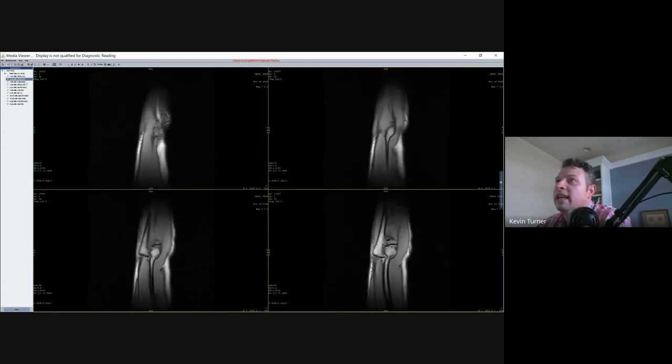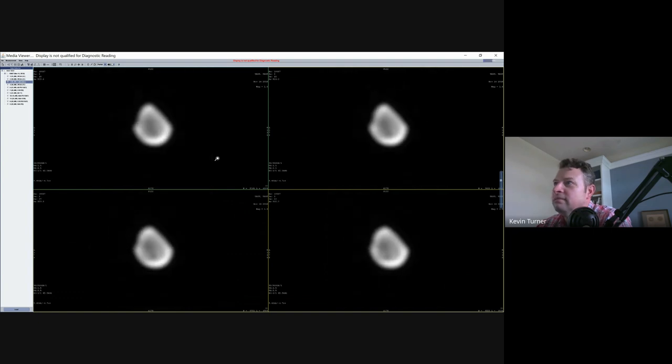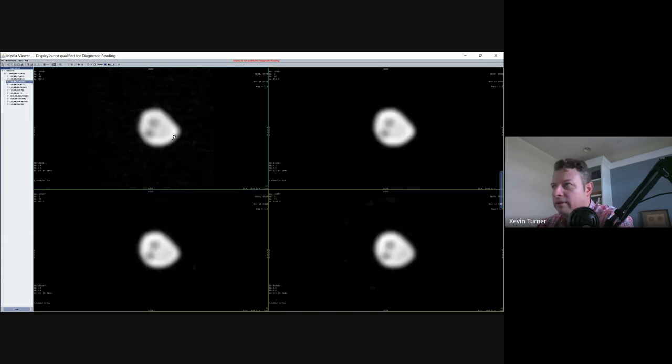Right? You can even look at a calibration scan. We'll get into calibration scans much later. You can't even see anything in here because this is all just for the computer.